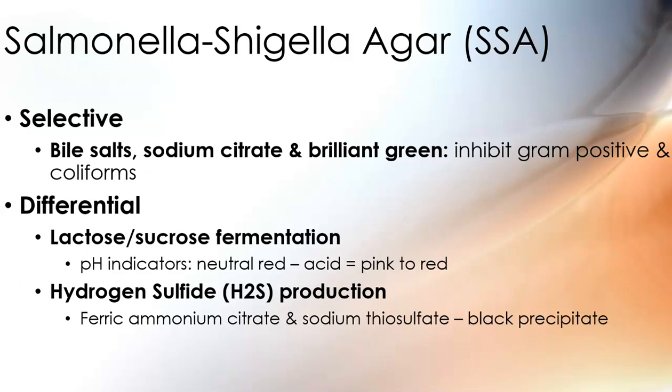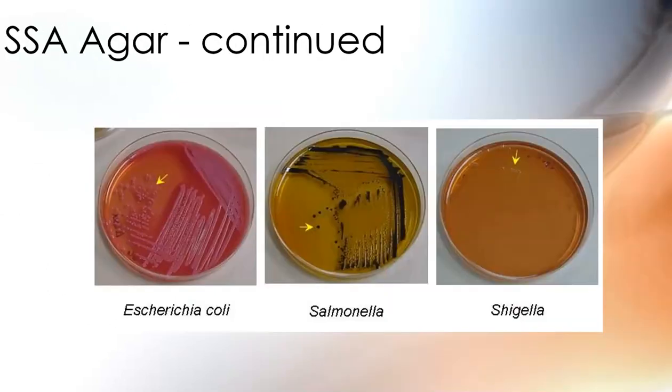I'm teaching you all this stuff. And there are a lot of labs that don't even do stool cultures anymore. There are still some that do it. So I have to teach it as long as you guys are being tested on it and as long as it is in practice out there. So can't help it, but there are some places that still do this.